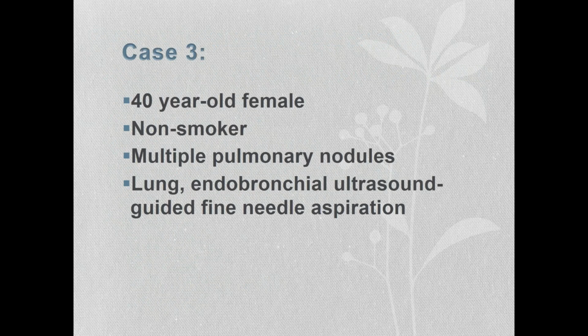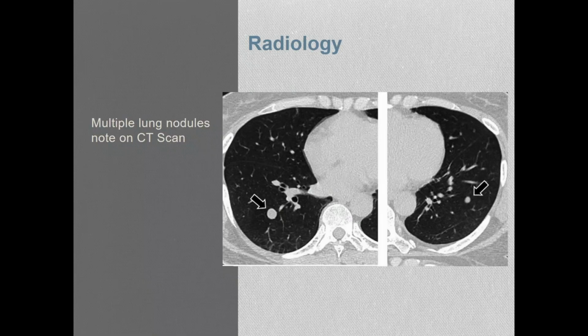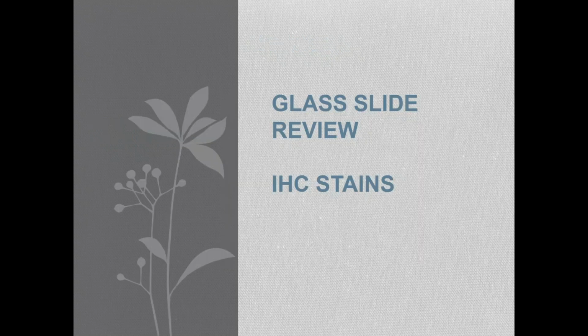Okay, we'll move on to case number 3. This is a 40-year-old female who was a non-smoker. She had multiple pulmonary nodules, which you can see here on the next slide, which are nicely marked. Endobronchial ultrasound-guided FNA of the lung lesion was performed.